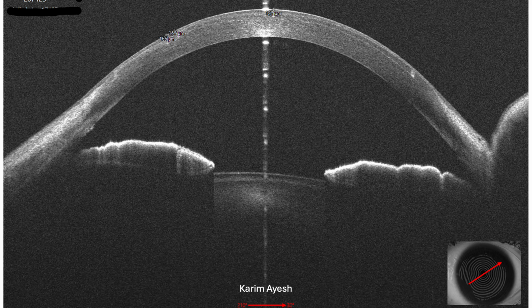This is the anterior segment OCT, spectral domain OCT. Here is the depth of the flap in the center area. The depth of the flap is 127, or around 130, so it's a reliable flap. And the scar is reaching almost 160, superficial in the lower layers and in the deeper layers, and a little bit denser in the superficial layers.